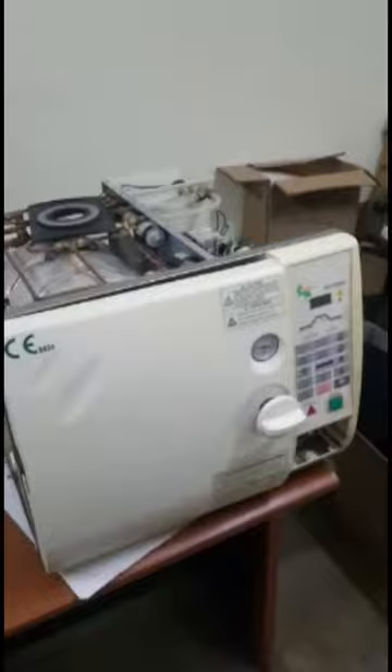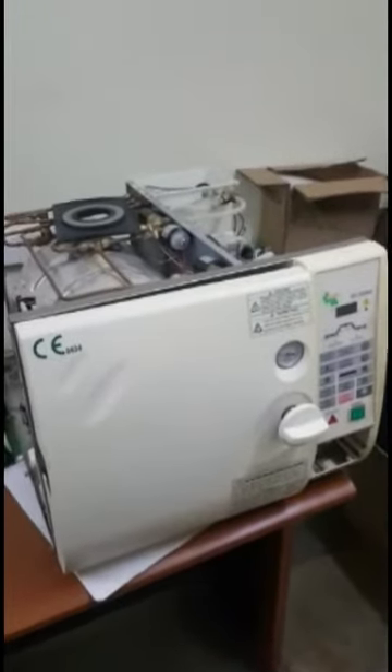Those are some few things we wanted to take you through. The whole idea about this exercise is to encourage colleagues to make similar videos of devices like this autoclave sterilizer, oxygen concentrator, and the suction machine, so that we make videos of this nature and teach each other, sharing the problems we've had and how we've been able to overcome them. Thank you very much. It's a pleasure talking to you.